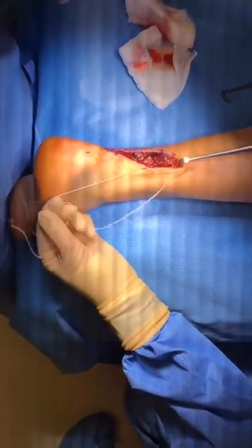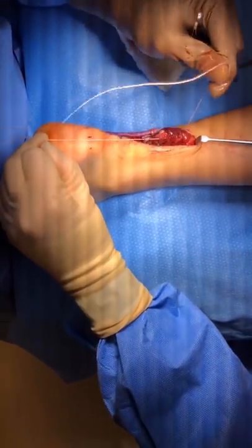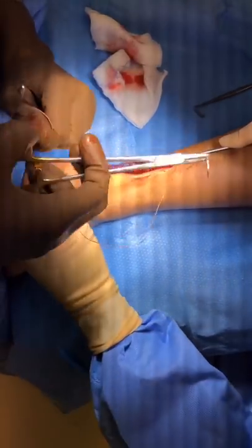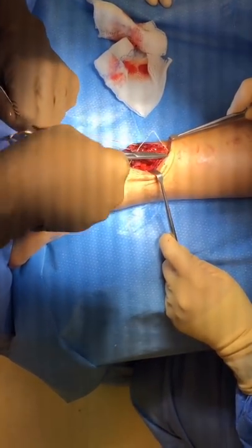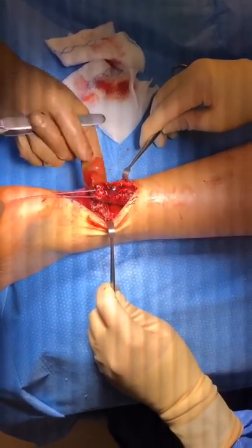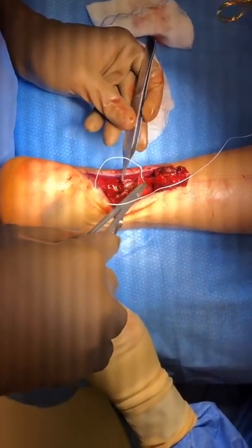We put this stitch all the way up the Achilles for several centimeters and then run it back down to the other side, then do the other side of the tendon. We put the Krakow stitch through this segment of the Achilles tendon here. You can see how I can pull on it hard and it is very sturdy. Now we will do the same thing on this segment, and then we will simply tie those two together.